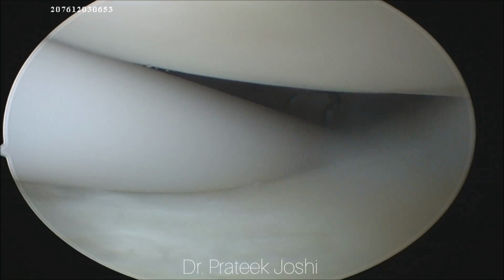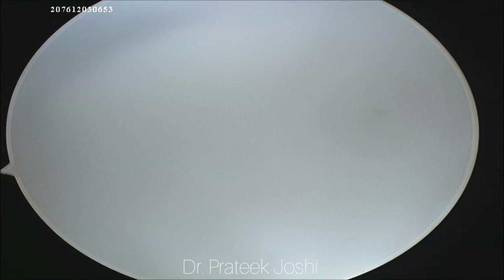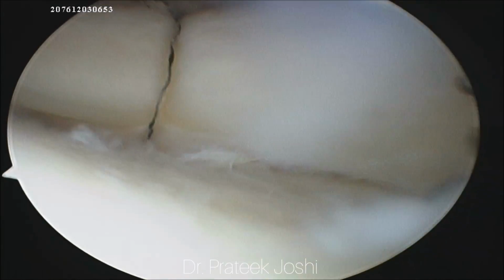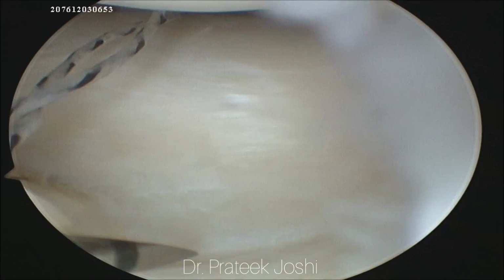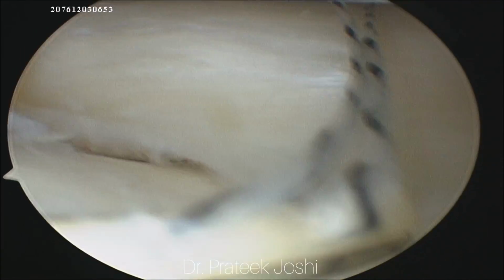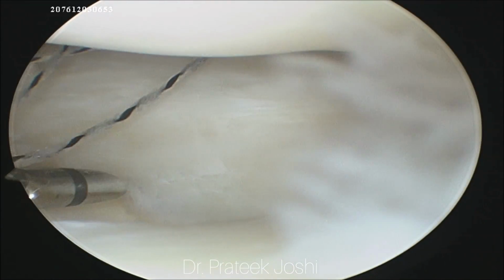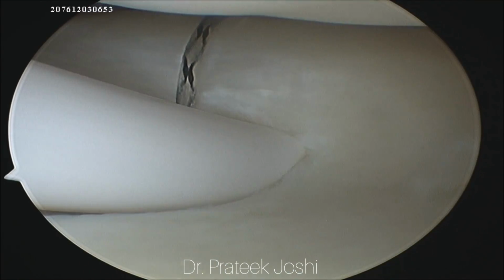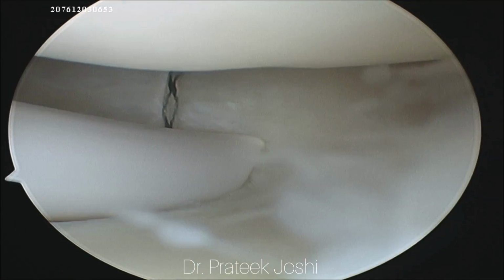So the first implant has been deployed superiorly, and now I am going to introduce my all inside device inferior to the lateral meniscus in order to pierce the inferior capsule, and then I am going to deploy my second implant. As you can see, I am finding it a bit difficult to orient my device in the correct position because of the tibial spine, but now I could engage the proper position of the capsule which I want to engage, and now I have deployed the second implant.